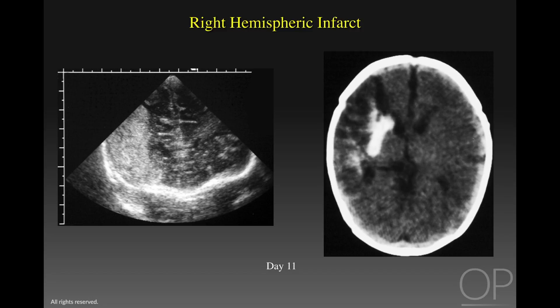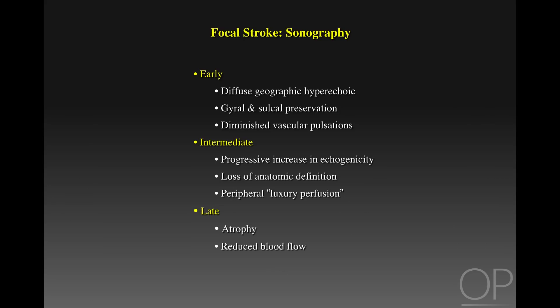The size of the hemorrhage on CT is much smaller than the echogenic lesion on ultrasound. It is therefore very difficult for ultrasound to distinguish between hemorrhage and stroke or ischemia because they have a very similar appearance. Focal stroke early on shows a pattern of diffuse geographic increased echogenicity with preservation of the gyral and sulcal pattern and diminished vascular pulsations on color Doppler. After two to three days and into the next week, there is progressive increase in echogenicity with loss of anatomic definition and the appearance of peripheral luxury perfusion well shown on color Doppler.